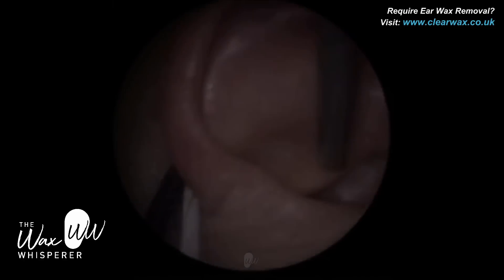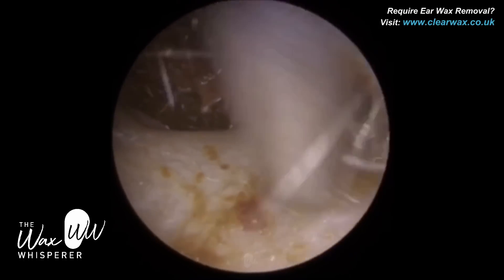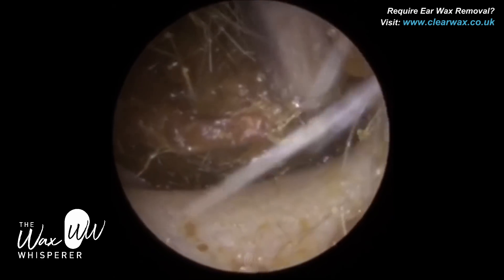The patient in this procedure attended with a blocked left ear. Just performing microsuction using a standard Zolder suction probe.